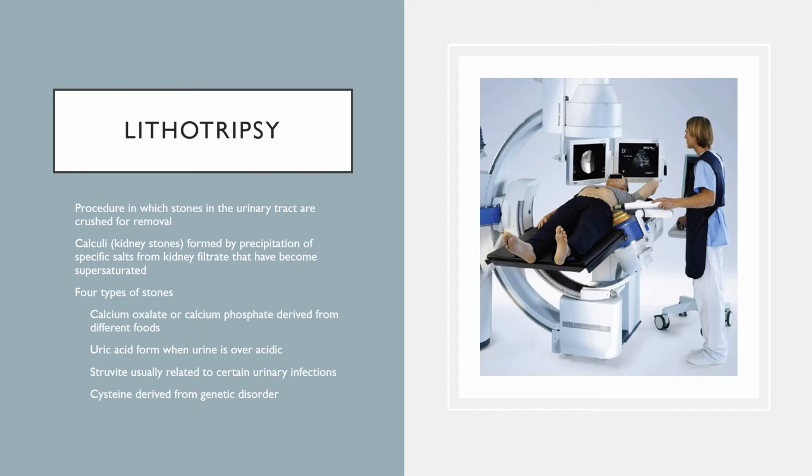So lithotripsy can be done. These stones can be removed extracorporeally or intracorporeally, meaning from the outside or the inside of the body. An extracorporeal shock wave lithotripsy, or an ESWL, you'll hear it called ESWAL, delivers shock waves to the stones under fluoroscopy from the outside of the body. It is extracorporeal. It's used on stones that are less than 2 centimeters. It is less effective on cystine and calcium oxalate stones.